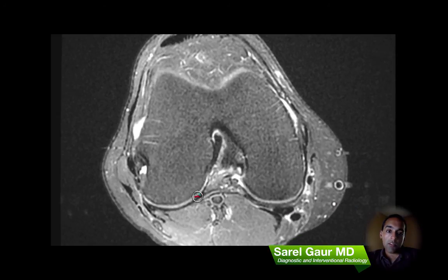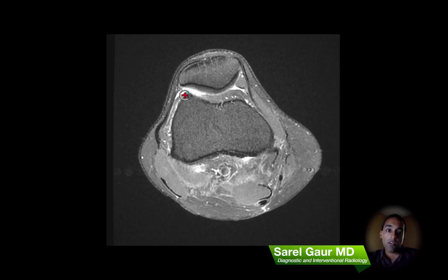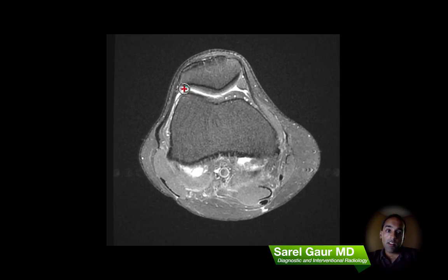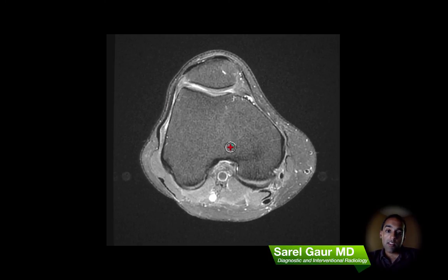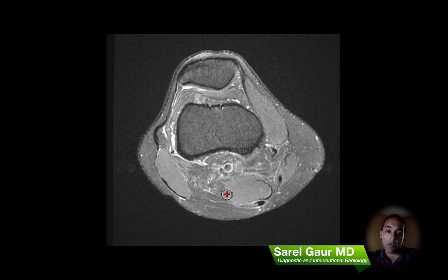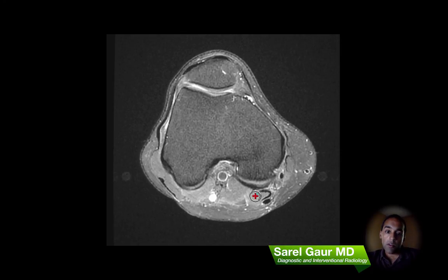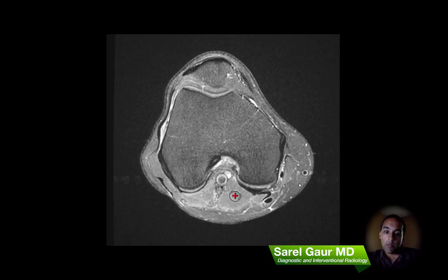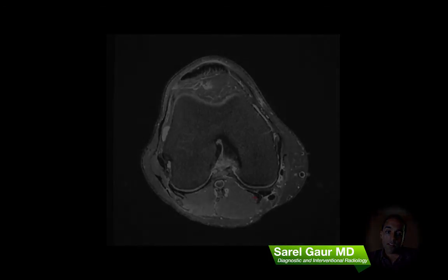So pretty much almost done. The last couple things I look at before closing off the case: I look for intra-articular fluid and try to rule out a joint effusion. Here you can see a normal amount of intra-articular fluid as this high signal here. I also like to look for a Baker's cyst, so I basically find the semimembranosus muscle right here, trace that down into where it comes into contact with the medial head of the gastrocnemius, which is here. A Baker's cyst basically originates right there, and the patient does not have one.